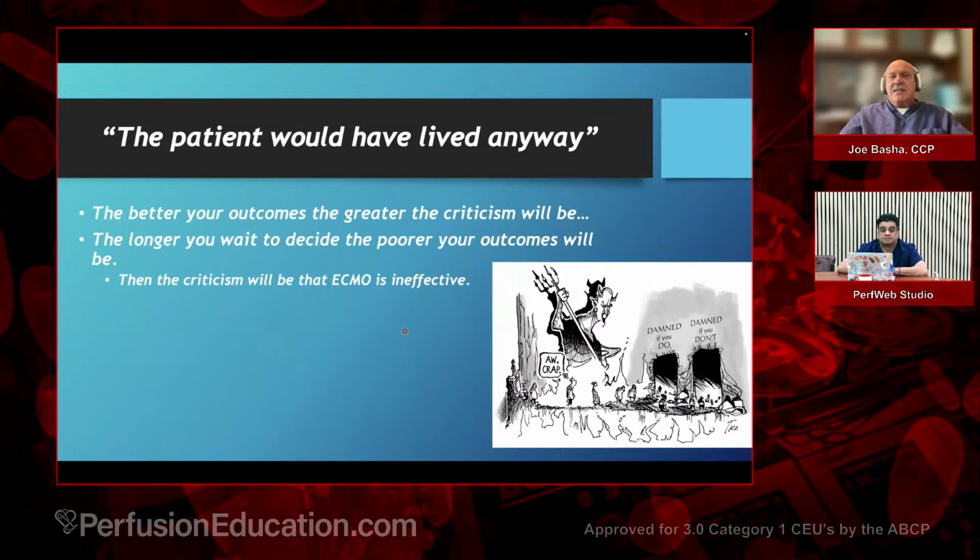But the criticism is the better your outcomes, the greater the criticism will be that if you had not put the patient on ECMO, they were probably going to live anyway. So they really didn't need ECMO if you put them on early. If you put them on really late, the outcome is almost always the same. They don't make it, in which case the criticism is ECMO was ineffective. What did you bother to do that for? So there definitely is a challenge with when do you put a patient on ECMO, because putting them on early can itself be a problem because ECMO is not benign by any stretch of the imagination.